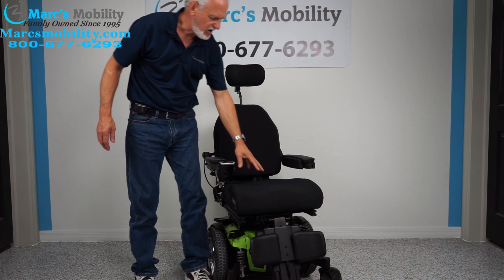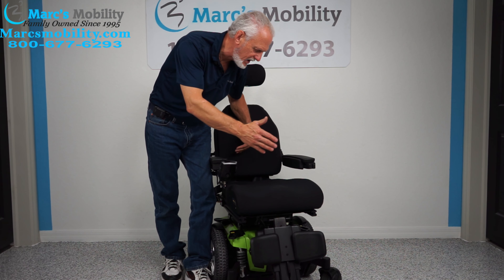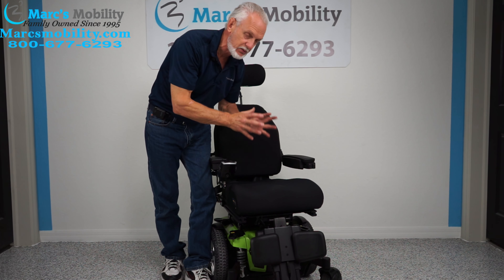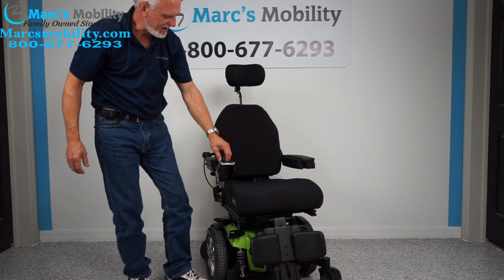The seats on these chairs are adjustable. If you need a 20-inch by 20 or an 18, we can take these cushions off, expand these seats, and change all the cushions so this chair will fit you. If you needed a chair fitted, just let us know and we'd be glad to help you out.